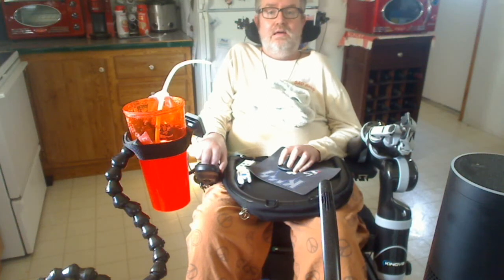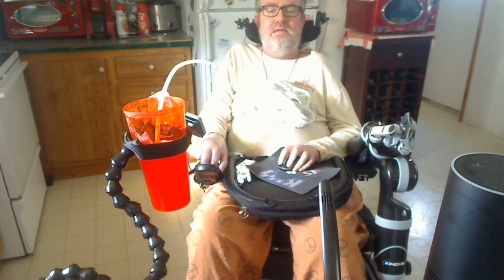Hi, my name is Barry Clarkland and I have ALS. I've had it since June 11, 2001, and I recently received a robotic arm — the Jaco robotic arm by Kinova, a Canadian company.